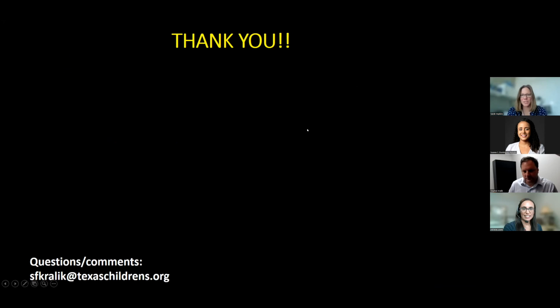Great. Thank you so much for sharing those images and the contrasting studies as well. That was helpful. If you have an initial scan that is a little bit unclear for a patient where you suspect AFM, what's the best time frame to get a follow-up scan? Around 10 days roughly is a good number. 7 to 10 is pretty good. Okay, and then you expect to see the abnormalities settle into the anterior horn on those follow-up scans? Yeah, you could get that.